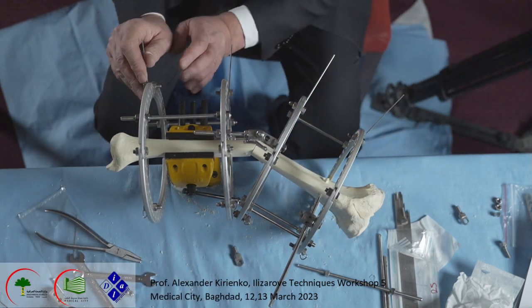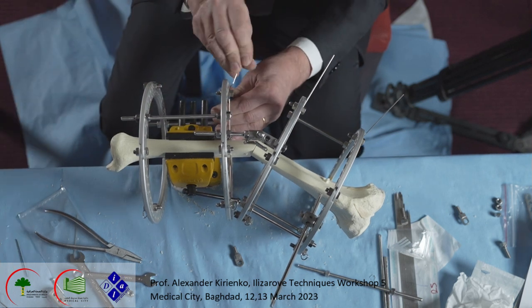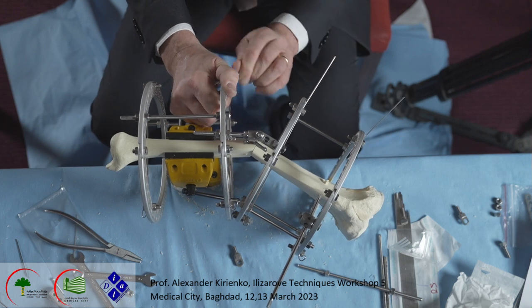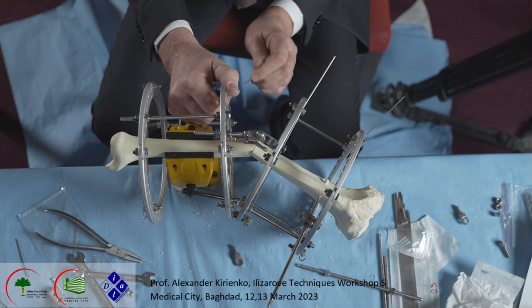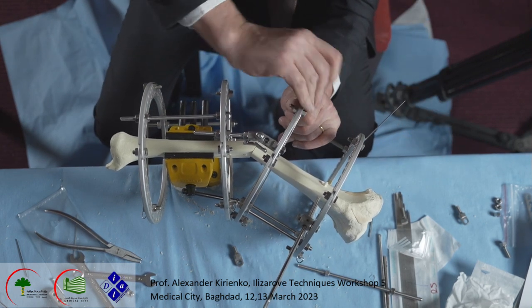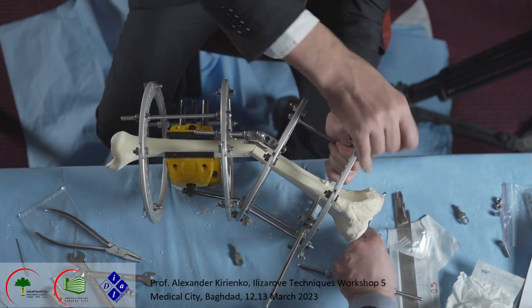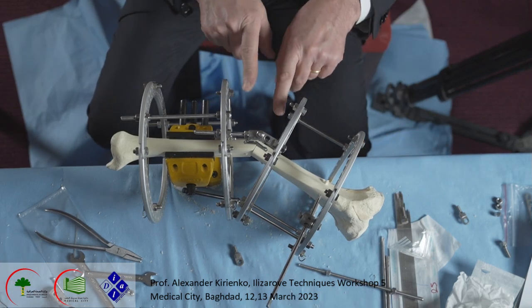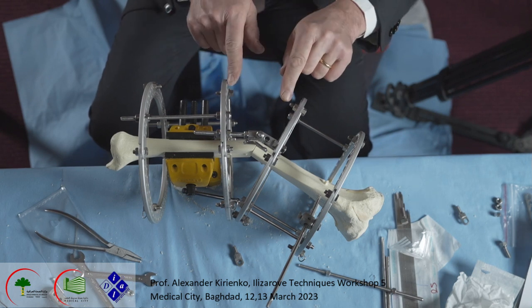Okay, here, if you want, we may break it. Okay, a different way of treating the wires. Now you see 2 olive wires from medial.